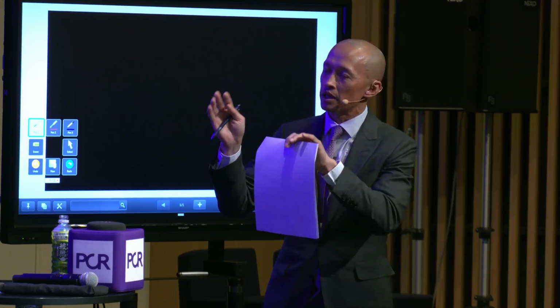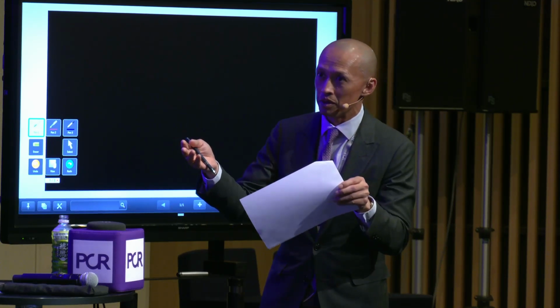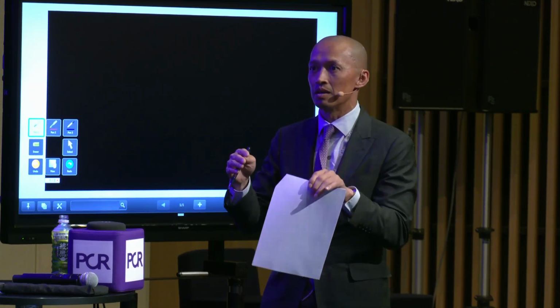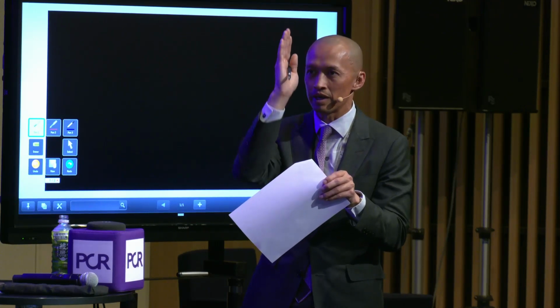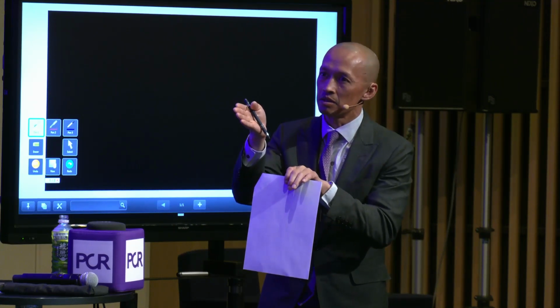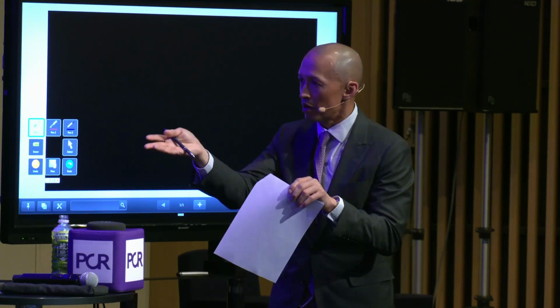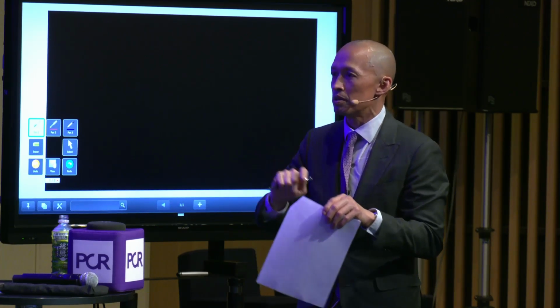I want to ask the panel about this case, because this is a case where there's very little leaflet tissue. So you have very little to work with, which means that sometimes when we put the first device, it makes things worse. I have a certain strategy that I've changed to, where I tend to go right down the middle first, because I think that creates the most coaptation for what little tissue you have. Here you went just a little bit lateral, thinking you might need 2 clips, but you actually pulled it together quite a way. When you have a broad jet, let's just say there's atrial FMR or deficient posterior leaflet tissue, where do you put the first clip?